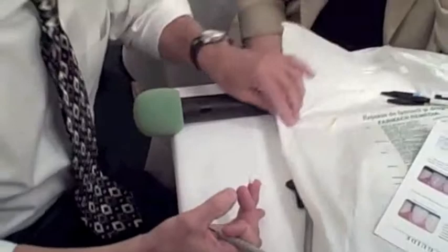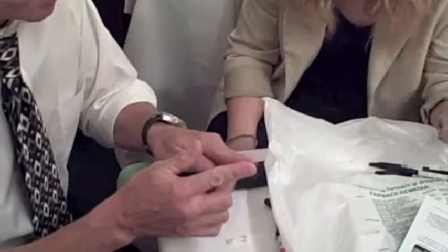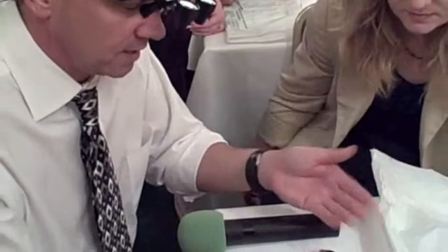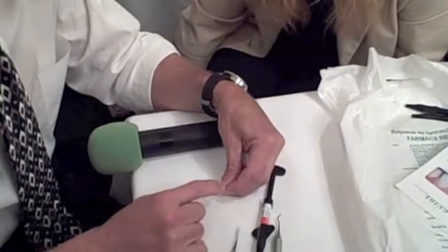If you do it yourself or you have an assistant, put the cap on it because it will go bad. What you're going to do — you want it not to stick — warm it just a little bit. Some people actually warm the composite with a heater, but I just rub it between my fingers and then take it with my finger and begin to adapt it like this.